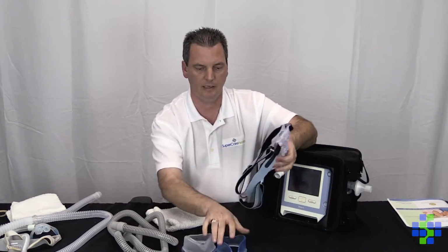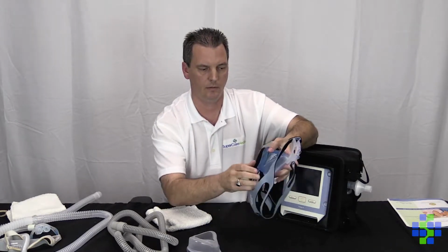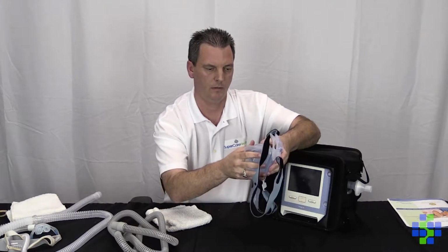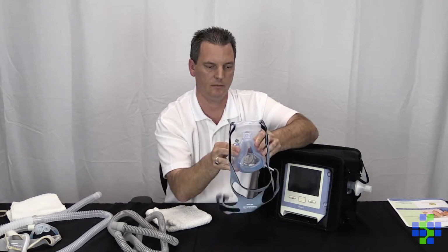Put the gel back in. I'm just going to pop that in place. Alright, and connect your interface.